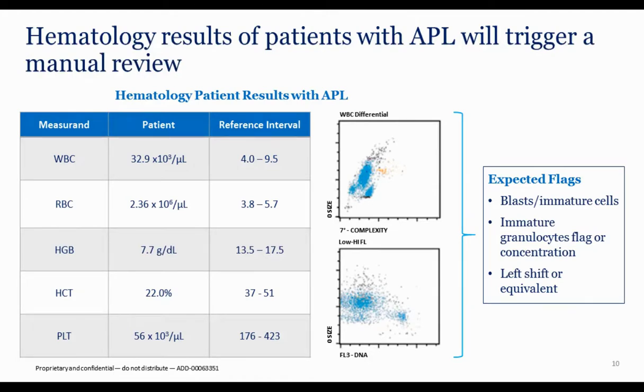In addition, we know that many of these patients who present with leukemia have anemia, and so here we would notice that the RBC count, the hemoglobin, and the hematocrit are all decreased, and this would be consistent with the picture of anemia. And then another result that's very important in the hematology lab would be the platelet count. And here we see the platelet count is decreased, and this too would be consistent with bleeding.